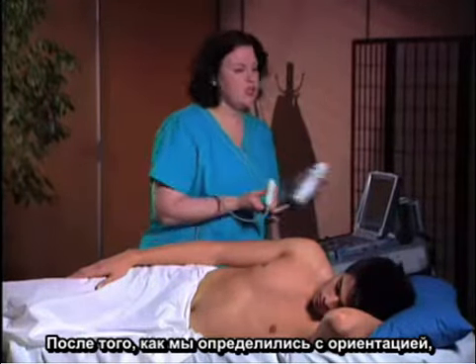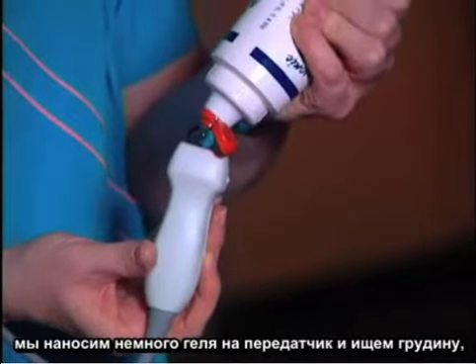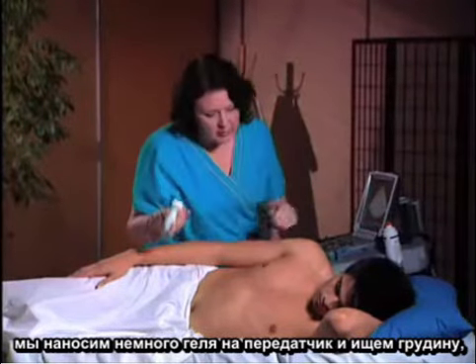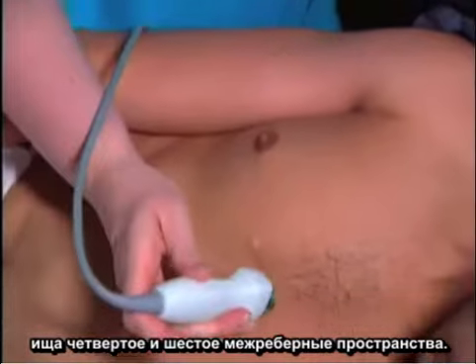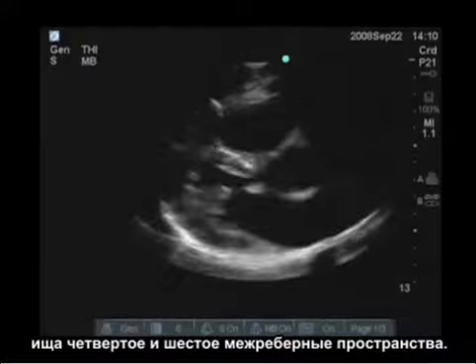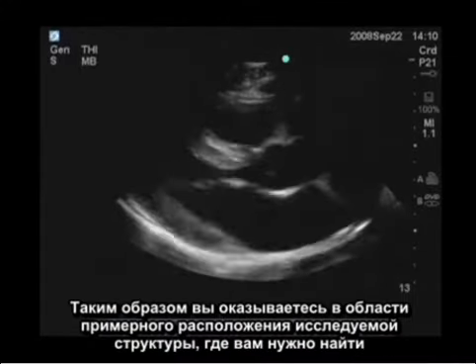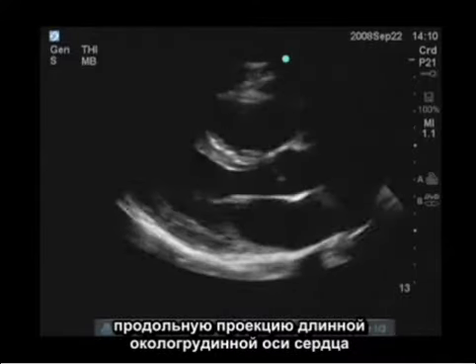So once we have the orientation figured out, we're going to put a little bit of gel on the transducer. And we're going to find where the sternum is. And move just a little bit left of the sternum, looking for the 4th to 6th intercostal space. And that should put you at least in the ballpark area for where you're going to find the parasternal long axis view of the heart.